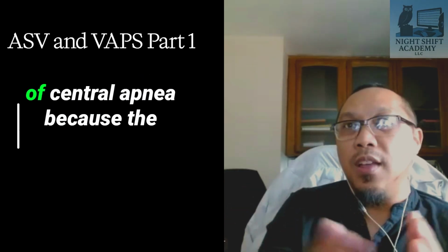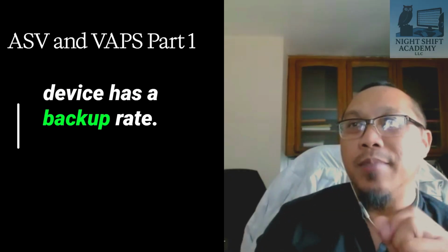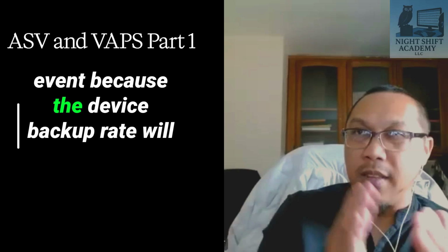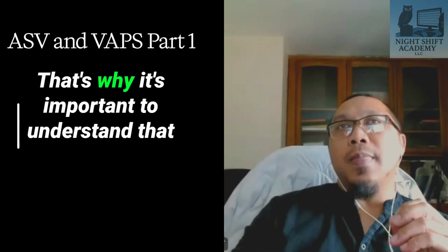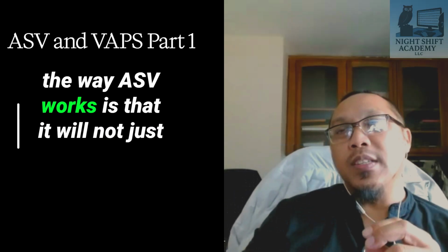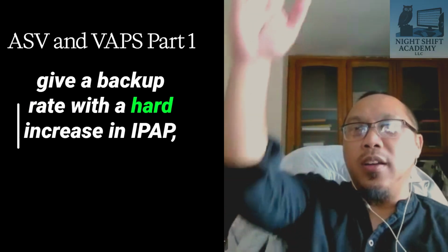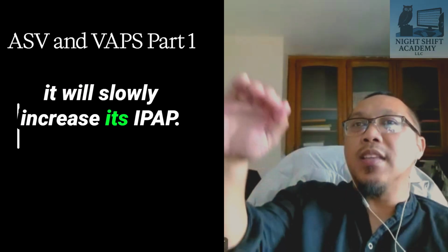The patient usually will not have 10 seconds of central apnea because the device has a backup rate. It will not allow the patient to have a central event because the device backup rate will immediately kick in to ventilate the patient. That's why it's important to understand that the way ASV works is that it will not just give a backup rate with a hard increase in IPAP. It will slowly increase its IPAP.